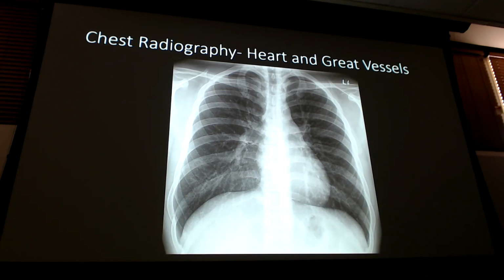Now I'm going to look at rotation. Okay? Spinous processes look pretty centered with that trachea. I'm happy with that. I think it's okay. It's close. But I can clearly make out both sides of the clavicle. And the key thing, if I'm on the fence going, is it rotated? Is that clavicle separated? I'm not really sure. Go back to my spinous processes. Those look pretty centered. Those things move with one another. So those are centered, so we're going to call that good. No rotation, no concern.